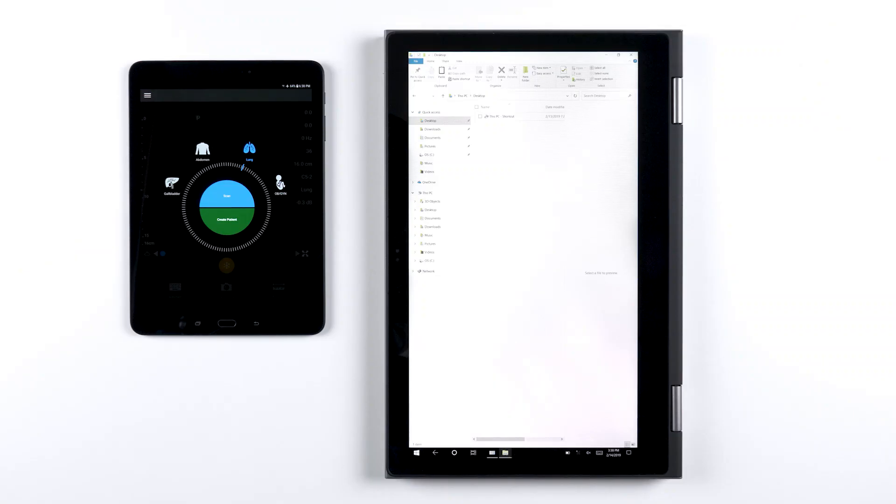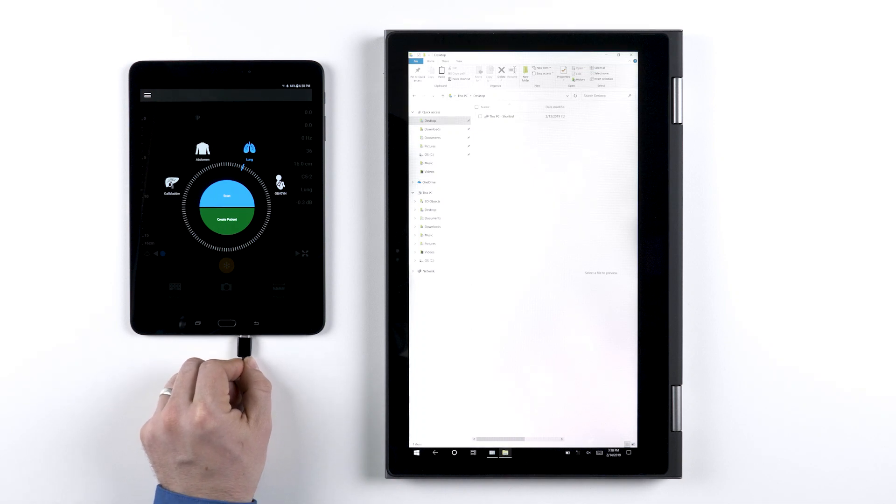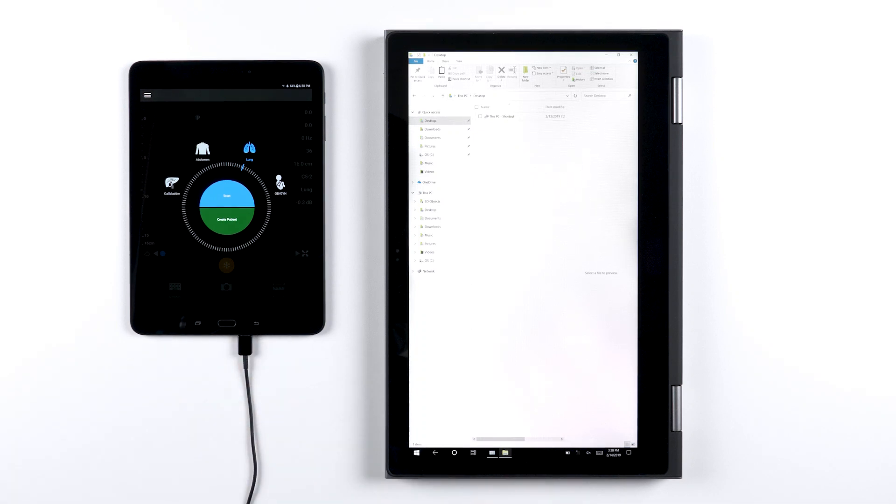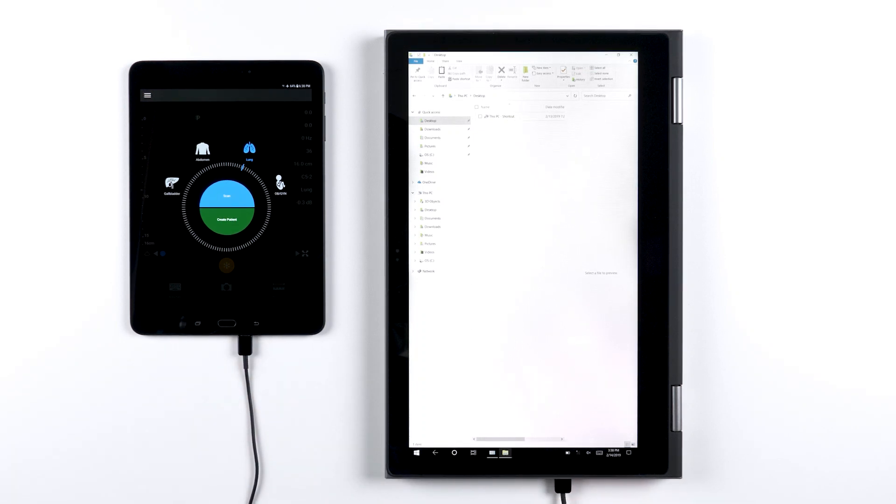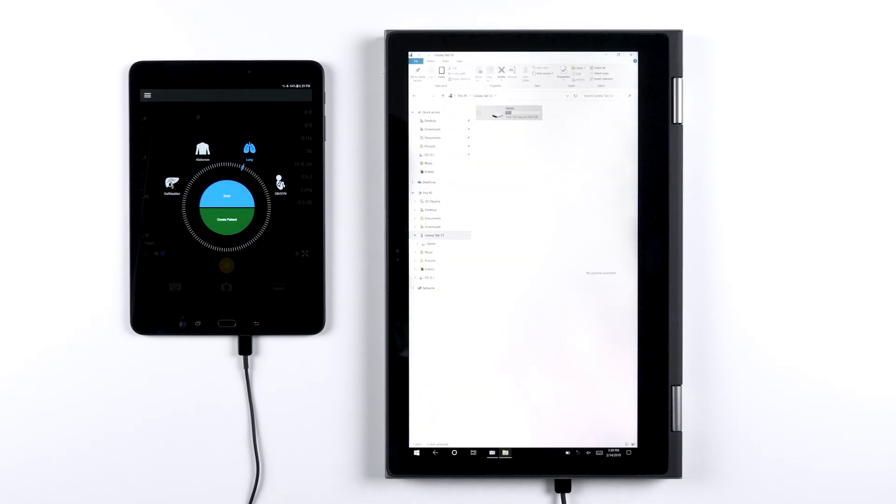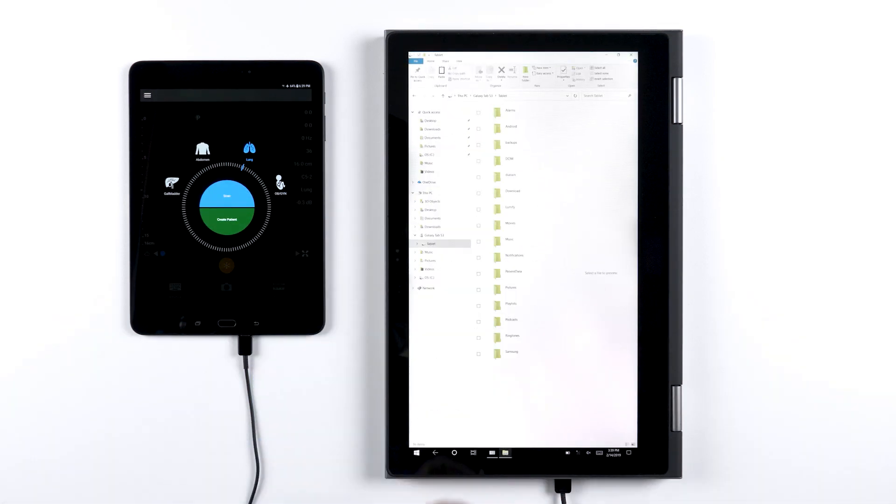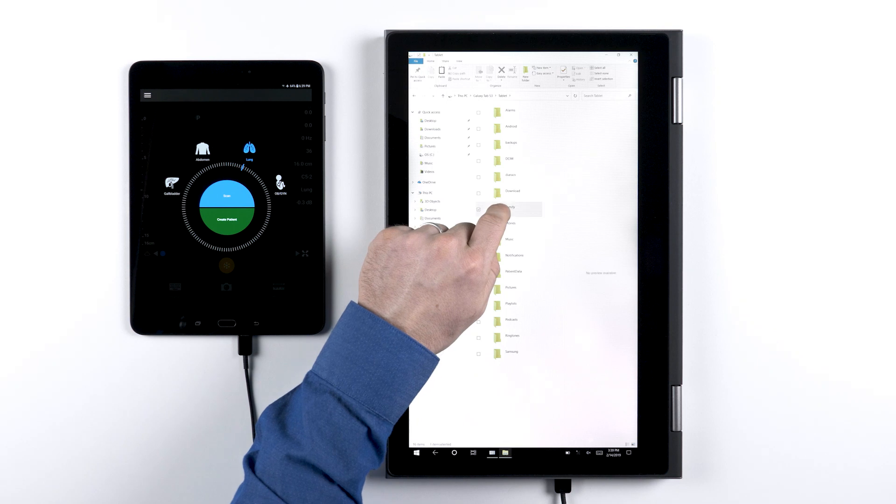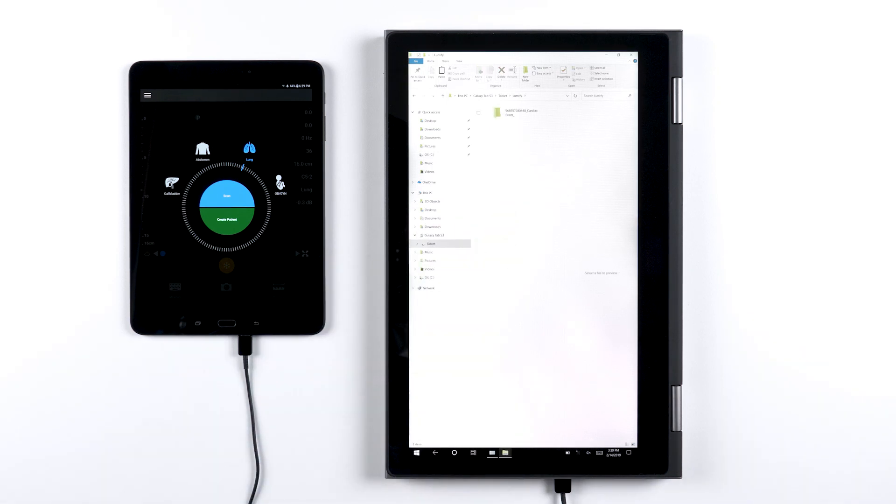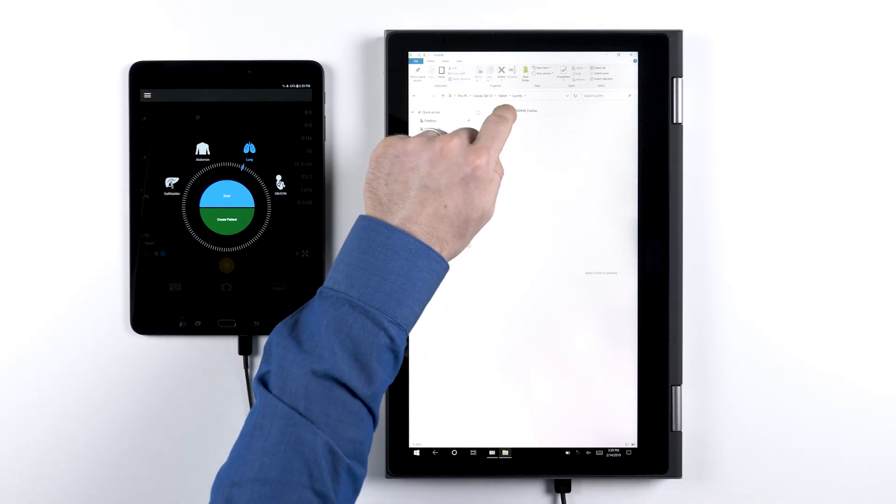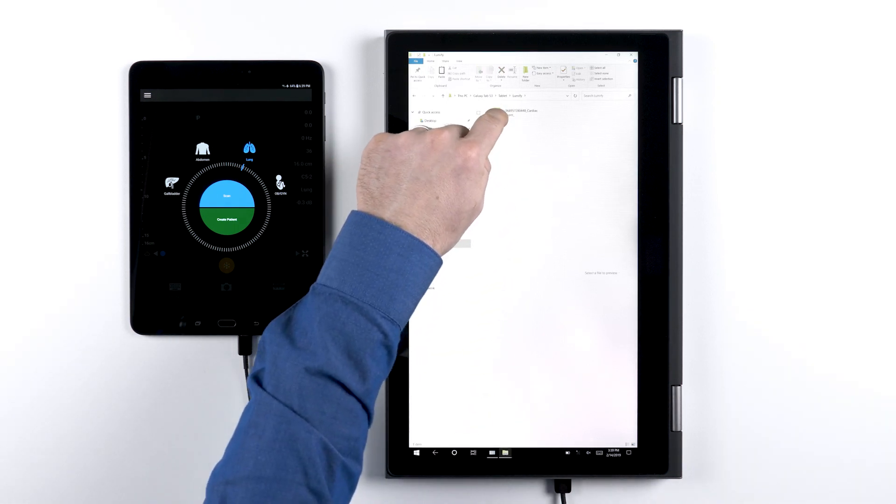One, by plugging in your mobile device to a computer with a USB cable. In this case your device will appear as a USB device similar to a USB thumb drive. Simply open it, locate your exams within the folder you saved them, then drag and drop those onto your computer or other storage location.